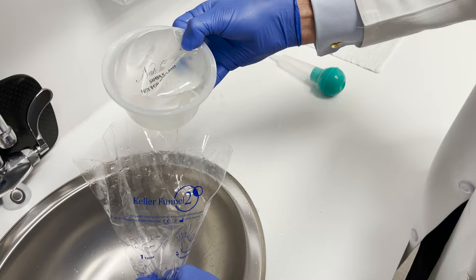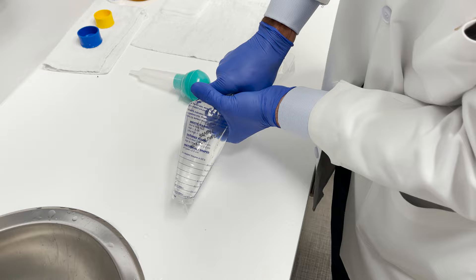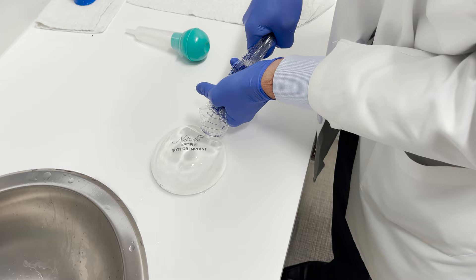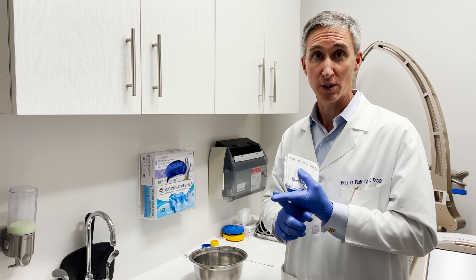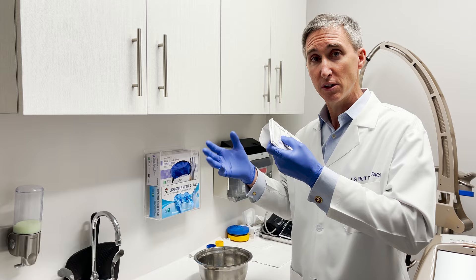Without any touching — we orient it, and then when we're ready to go, it's a very simple, smooth expulsion right into the pocket. It reduces strain or potential trauma to the implant. We can put reasonable size implants through smaller incisions, but most importantly it allows us to do what's essentially a no-touch technique, so nothing really touches the implant.